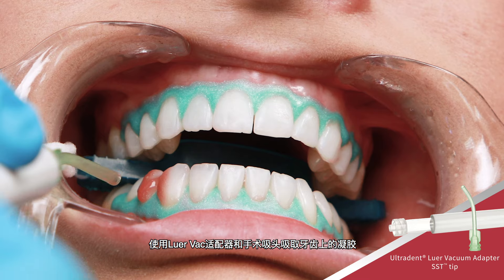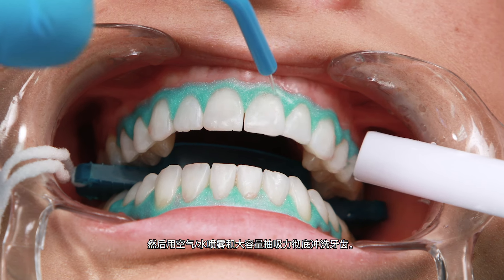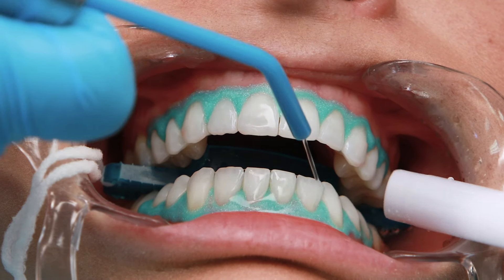Suction gel from teeth using the Luer Vac Adapter and Surgical Suction Tip, then thoroughly rinse teeth with an air or water spray and the high-volume suction.